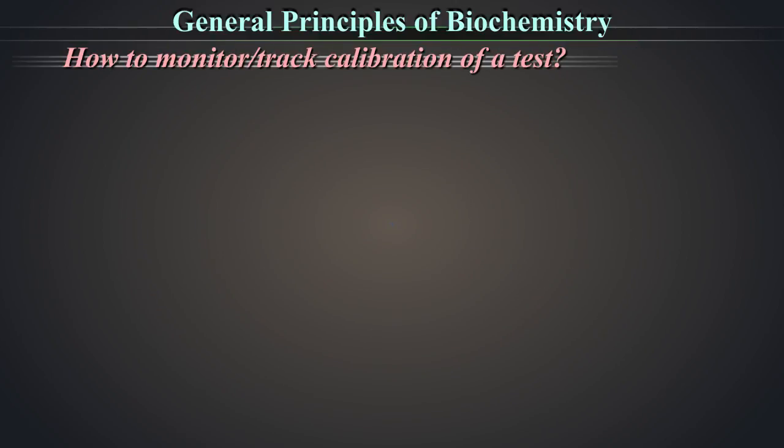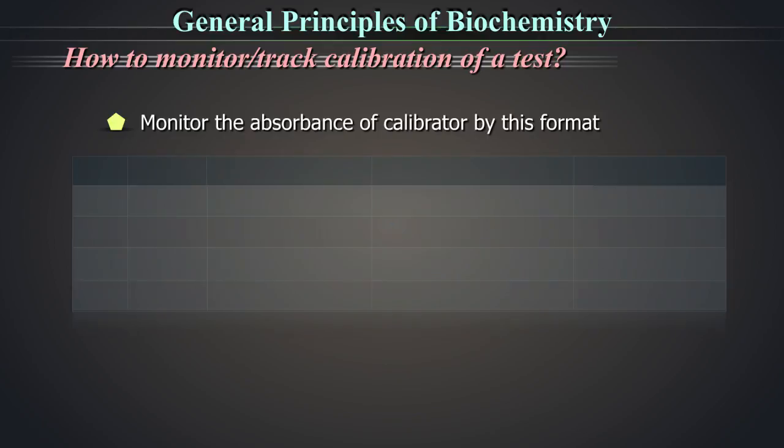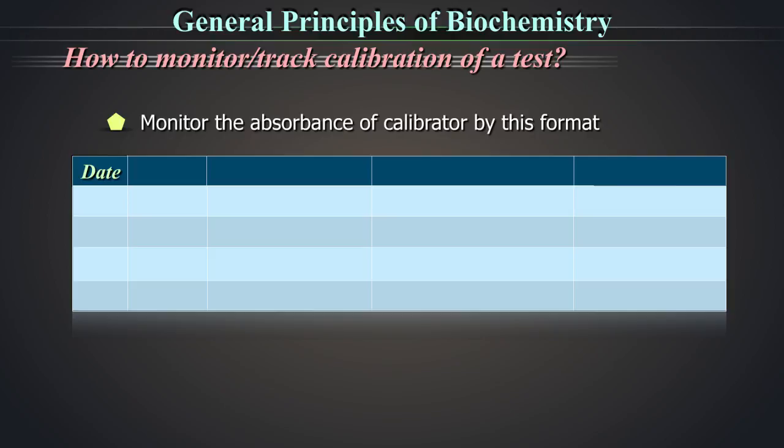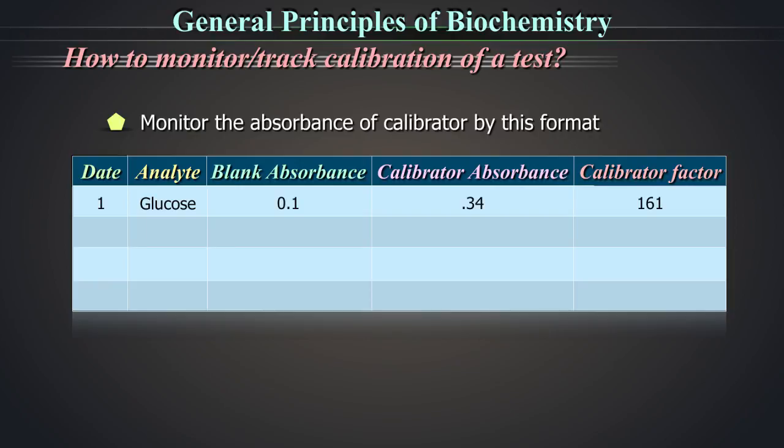How to monitor or track the calibration of a test? Monitor the absorbance of calibrator by the given format. For example, you run the calibrator for glucose. You can see from the log that the blank absorbance, calibrator absorbance and the calibrator factors are all within range for day 1, day 2 and day 3. But on day 4, the values are out of range. This is an indication to troubleshoot and rerun the calibrations.